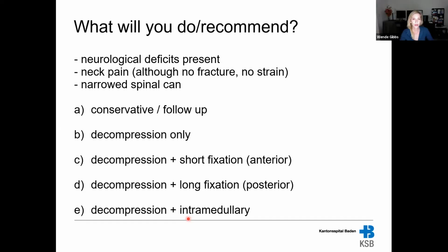Hey, Alex, while people are putting in their votes, can you show, you told me there was no disc down there by where you're saying that enhancement. The cervical spondylotic myelopathy would be the enhancing part down in the lower cord, like T1-2. And it looks to me like there's a disc there, and you need some inciting event to have cervical spondylotic myelopathy, some kind of compression, right? So I think that would influence your answer if that is true.